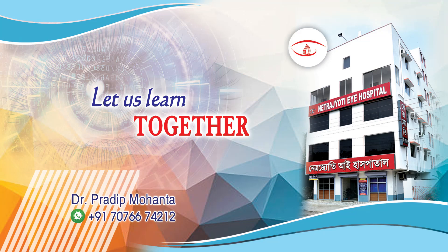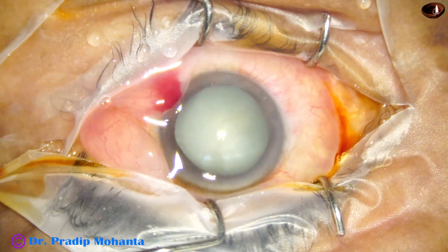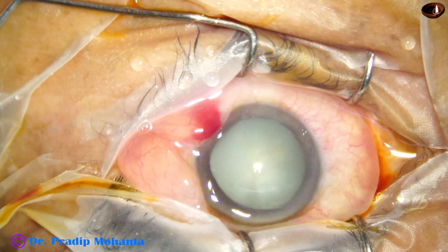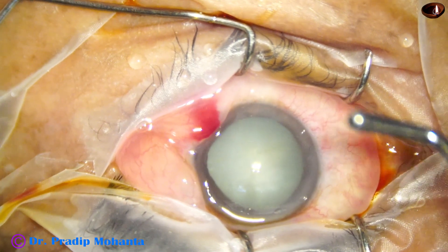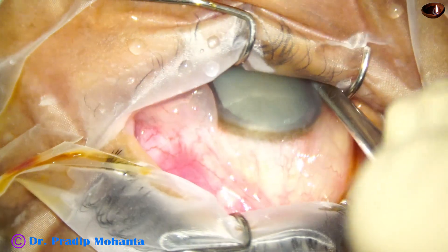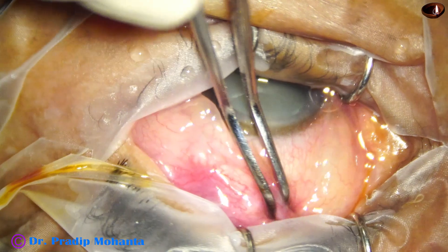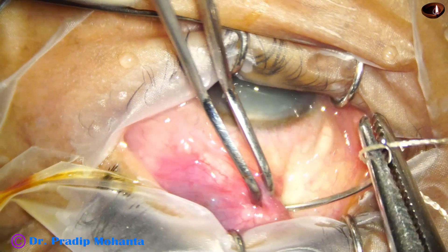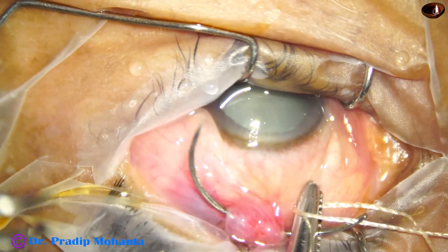Friends, welcome to my workplace at Ranaghat, West Bengal, India. This is a totally unedited surgery. In this surgery, I am going to share what I was thinking at every step. This is a case of phacomorphic glaucoma. The patient came with intraocular pressure of 60 mmHg. The anterior chamber is almost flat. There is steamy corneal edema and Descemet's membrane folds — all these things are there.